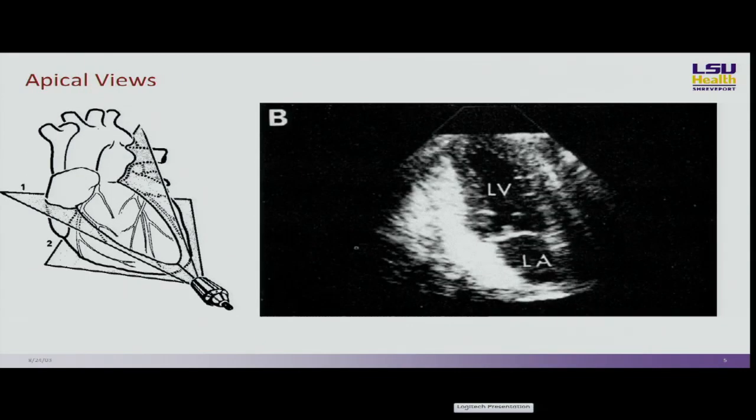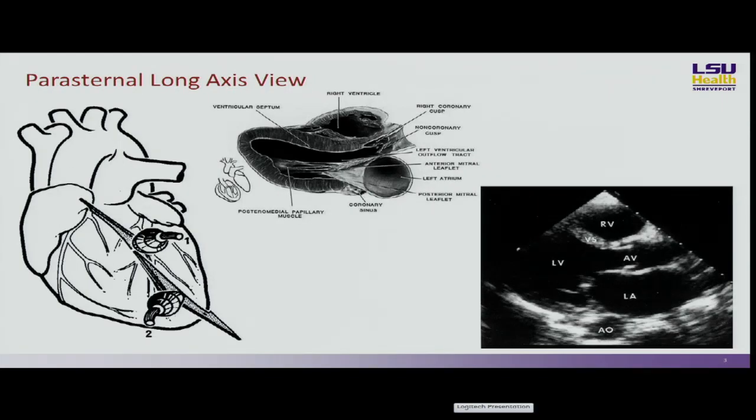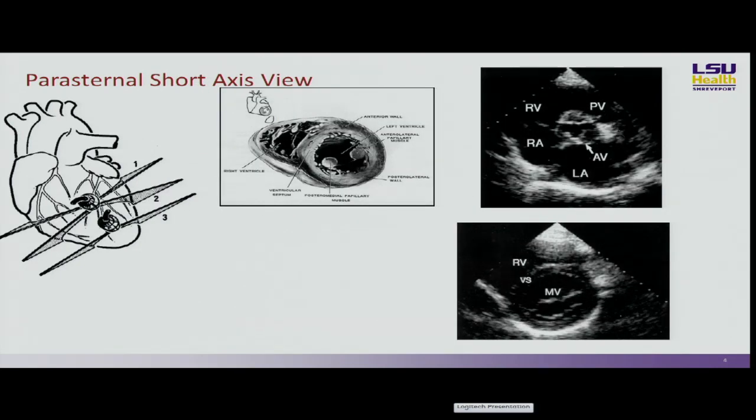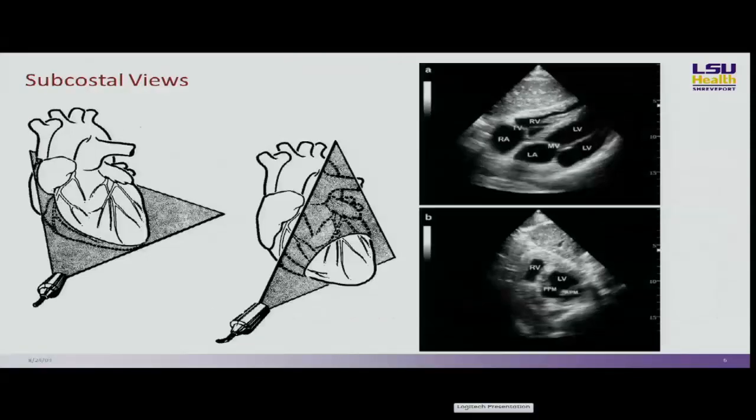You have to get it in line with the ejection of the heart. So you can't really get it from these views here because you're not in line with the aortic valve, you're perpendicular to it. The subcostal, you're off at an angle on the subcostal. This is the subcostal view here. So you might be able to get it subcostal, but usually the apex, instead of being here, is off to the side and it's too much. And I'll show you what the limitations are and when you can trust that measurement or not.